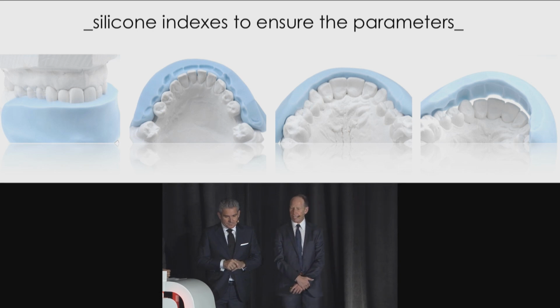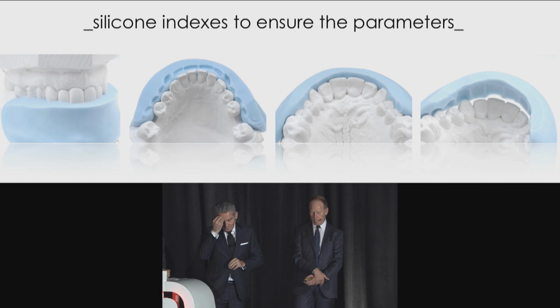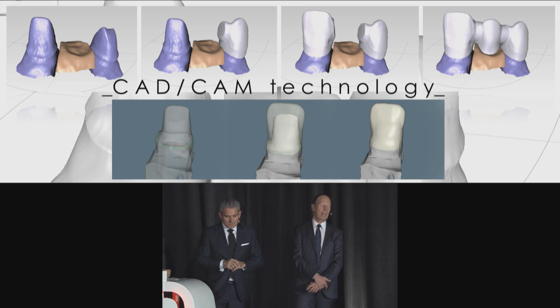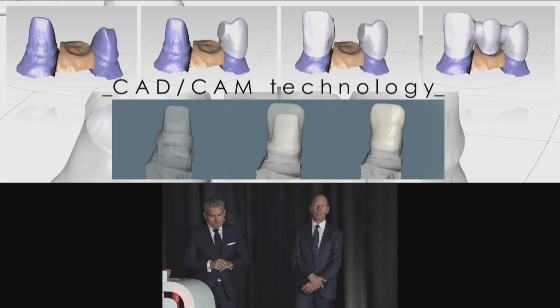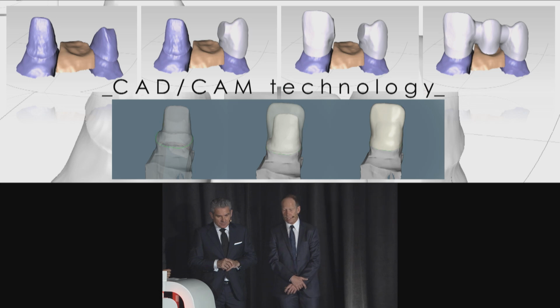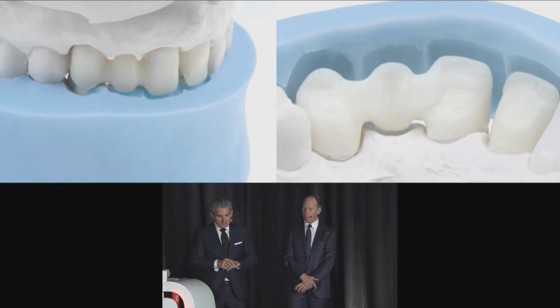On the right-hand side, you can see that this is to create the design of the bridge and the copings, as you can see here. So basically, it's very important that we have sufficient support of the ceramics. This is one of the main reasons why we had chipping in the past. There were a lot of reasons, of course, but I think one of the main reasons was the lack of a good design of the substructure. Here you can see when we close the articulator, on the left-hand side, that there is sufficient space for veneering material.